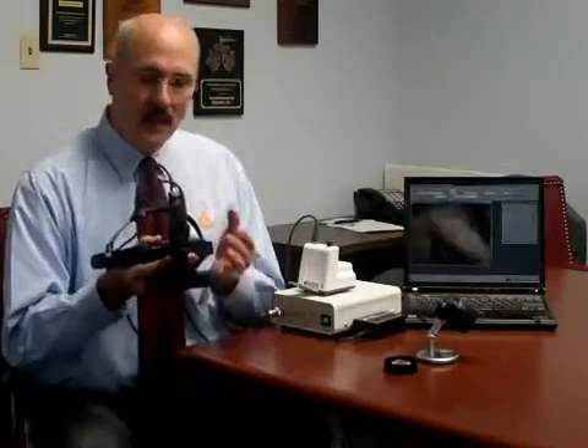Hello, my name is Alan Wassel. I'm with Heine USA. I'm here at Universal Ophthalmic Instruments in the Houston, Texas area and would like to present to you our Video Omega 2C.